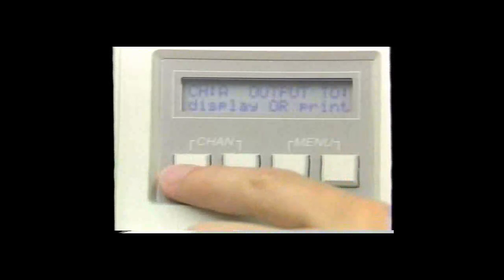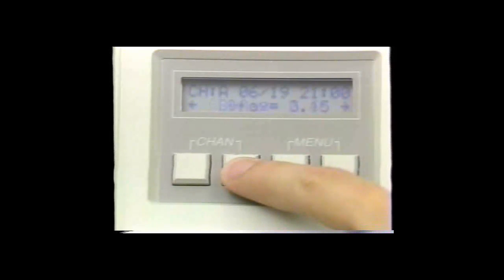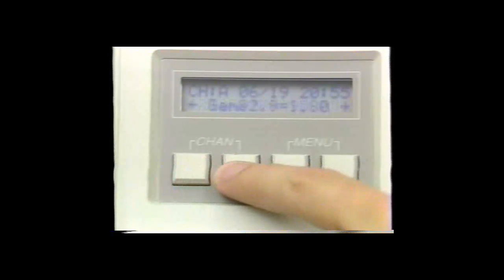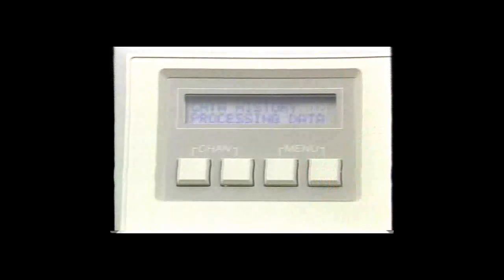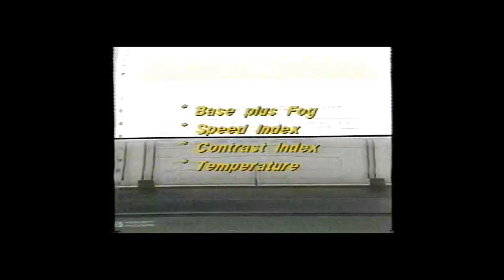The third data presentation option demonstrates the full power of the 381. The densitometer will store calculated data, processor temperature, the date, and the time of day for each strip that is read. The 381 will accumulate data from up to 32 control strips for as many as 12 processors. To get a complete report on any processor, select the processor number and push the history and print buttons. The 381 will print trend plots of base plus fog, speed index, contrast index, and temperature — or any three of six parameters stored in memory.